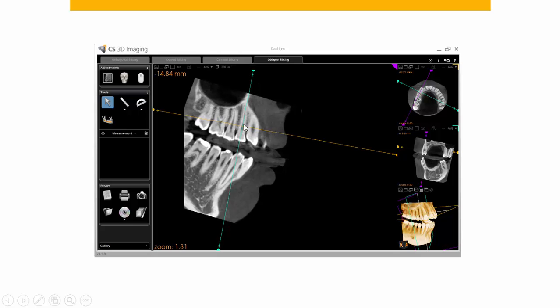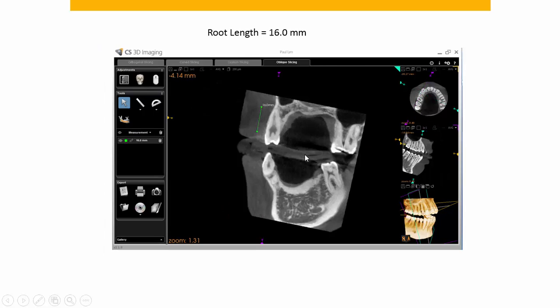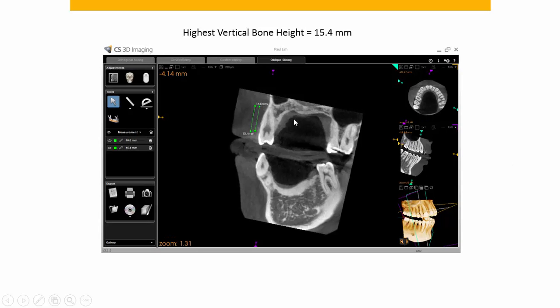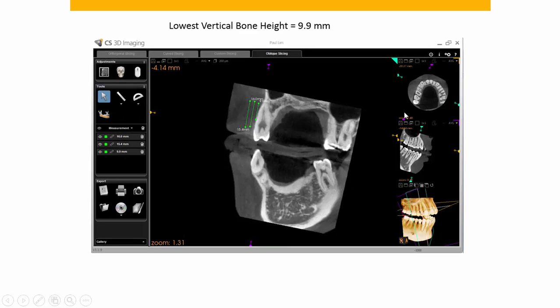All measurements have to be taken either perpendicular or parallel to the long axis or facial axis of the tooth, or else you'll get variations. From the sagittal view you can see we're straight down the long axis of the tooth and perpendicular to the long axis for the partial bone zone measurement. Using the ruler on the left, the root length from the apex to the CEJ comes out to 16 millimeters. The highest vertical bone height from the apex is 15.4 millimeters, and the lowest vertical bone height is 9.9 millimeters.